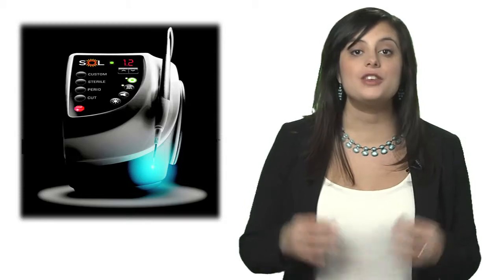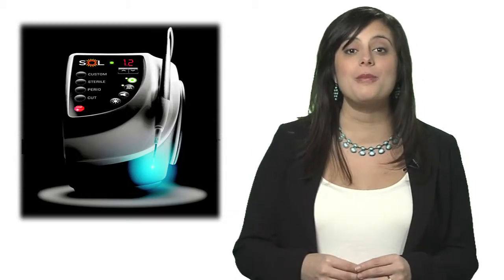Using the SOL diode laser for troughing creates a separation between the hard tissue margins and the gingiva, while simultaneously stopping any tissue bleeding prior to taking an impression or restoring a subgingival margin. This quick, bloodless procedure can save you time and will minimize the frustration of working with a retraction cord.